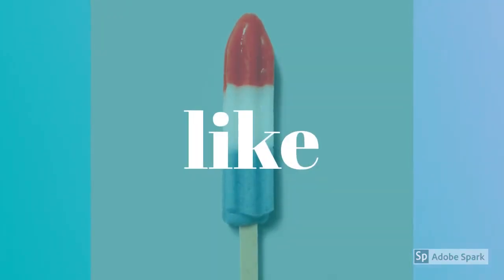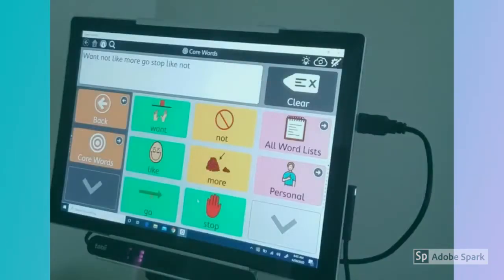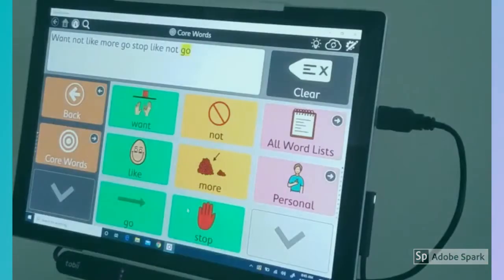Your student can use these words to express an opinion, like, to tell about something that's going to happen, go, to make requests for things they want, as well as many other things. Want.